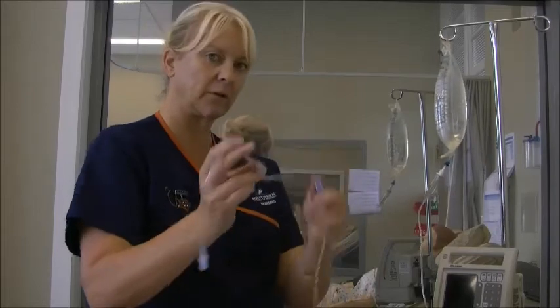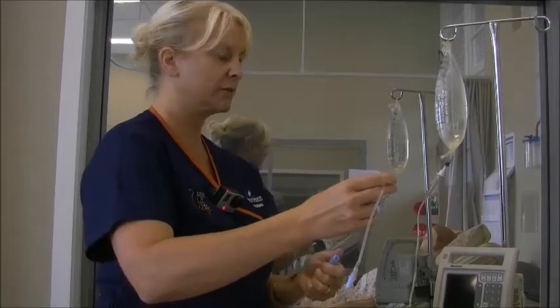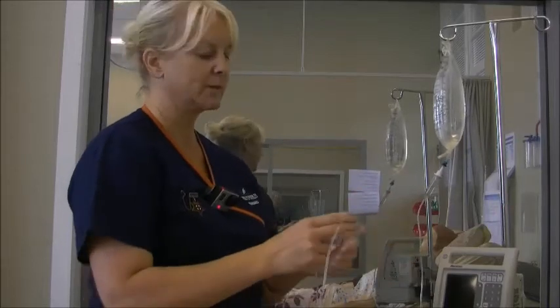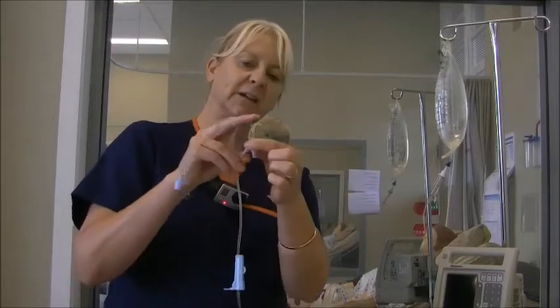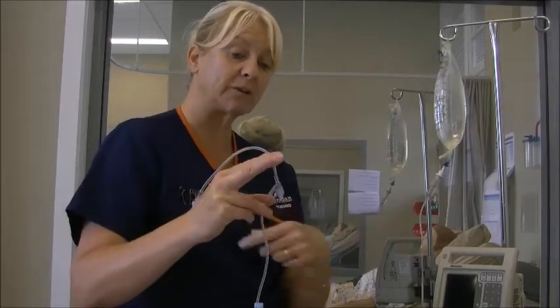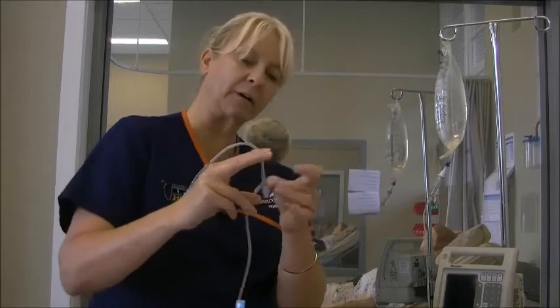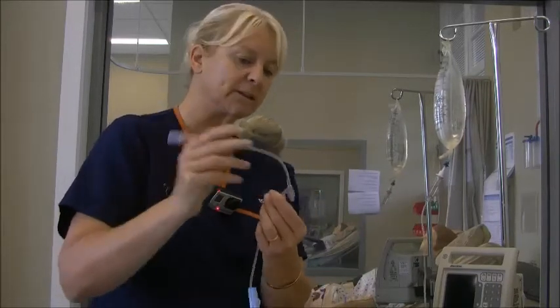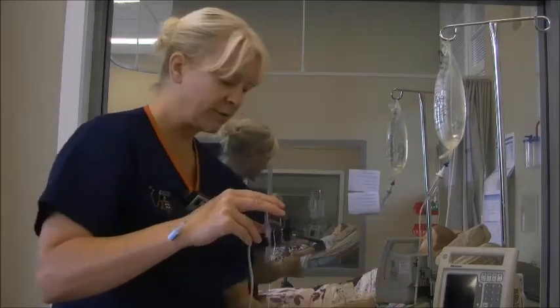So I'm just going to get the roller clamp and release it really gently, and I'm going to observe the fluid coming down the line, because when it gets to this intersection here, I want to make sure there's no air in there, because that's used as an injection port. So when it gets down to this area, I'm going to flick it so that the air is released from there. I'm just watching it come down slowly.